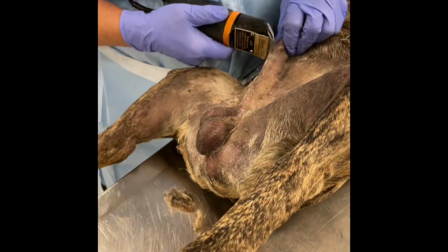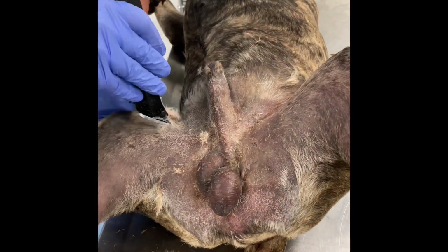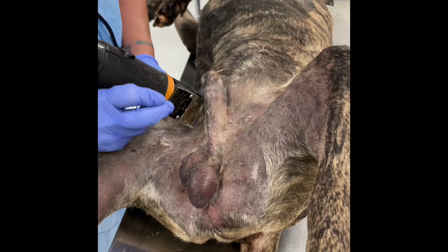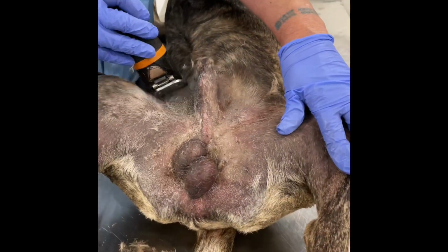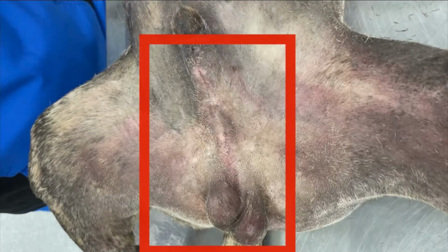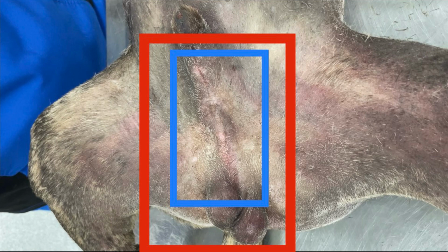We do shave quite a bit larger than you would in private practice for this class and for the operating room upstairs. This just gives us better access for everything. You can see here that this is the ideal area that we're going to shave for this class. It's still a little big for what you would do in private practice. And then here in the blue square, this is a little bit more realistic for what you're going to see in an everyday clinic.